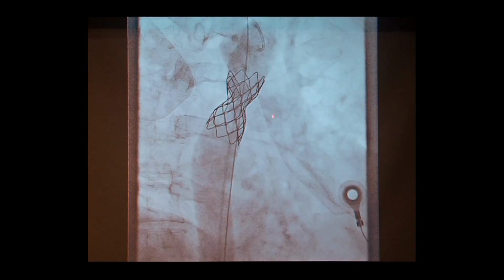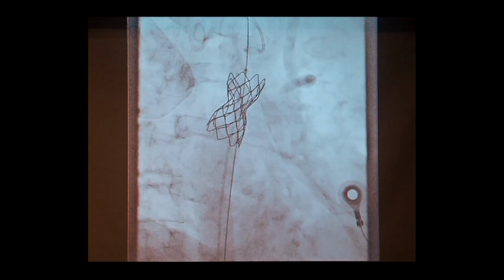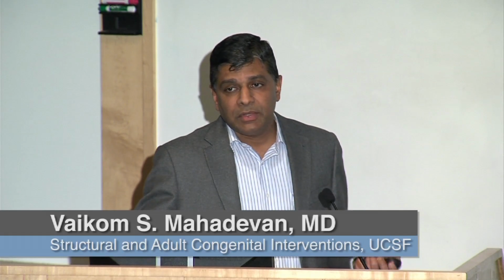If you look at it, look at the aorta now. It's hard to believe that you can achieve all this without ever having to cut open someone's chest. Because we do know when you do surgical procedures, although the outcomes are often very good, the risk of complications is much higher. That is not to say intervention does not carry risk of complications. It does, and sometimes things do go wrong. You can have a tear of the aorta, a rupture of the aorta, which all can sometimes be fatal. But more often than not, you can get a very good result, and with this, the patient goes home the following morning.